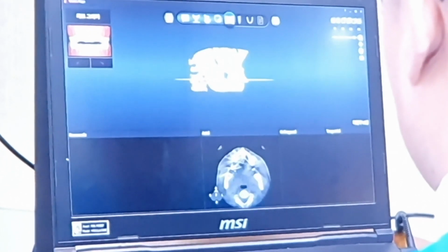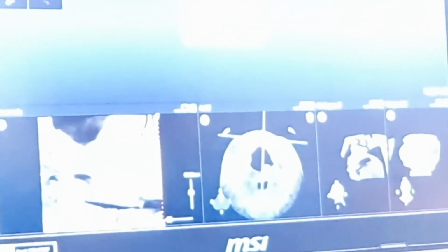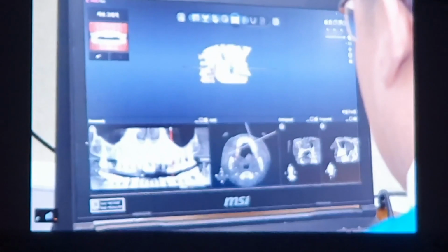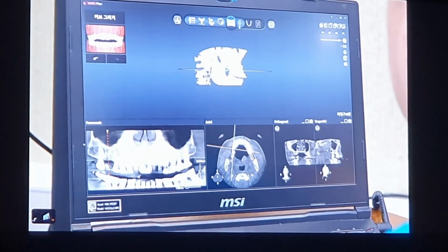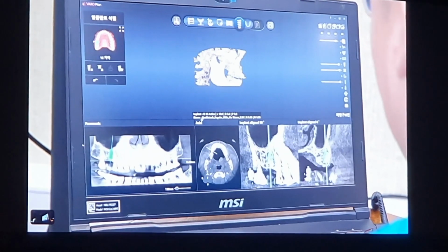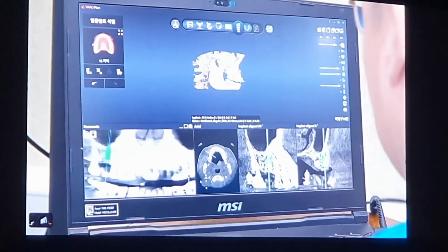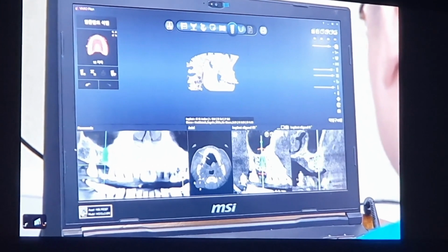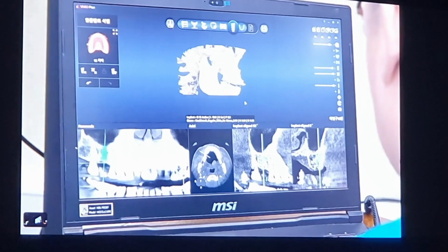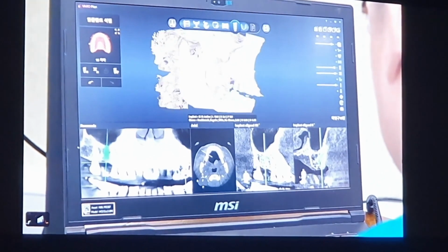As we confirm the positioning of the tooth, the implant is automatically positioned in place. So we are doing it right now. Once again, first register the patient, open CT data, merge the tray on the CT data, then place the final restoration on the tooth. It appears as green here. The implant is automatically positioned depending on the tooth position. And then we can touch on the details.